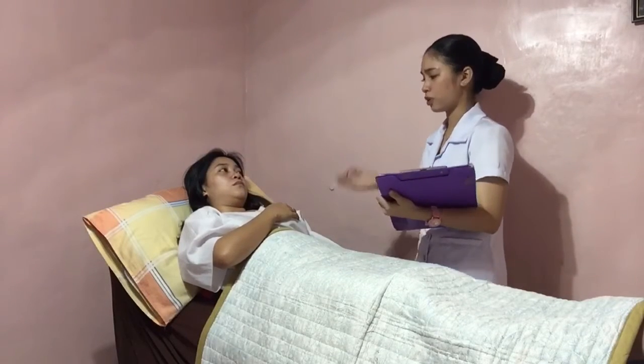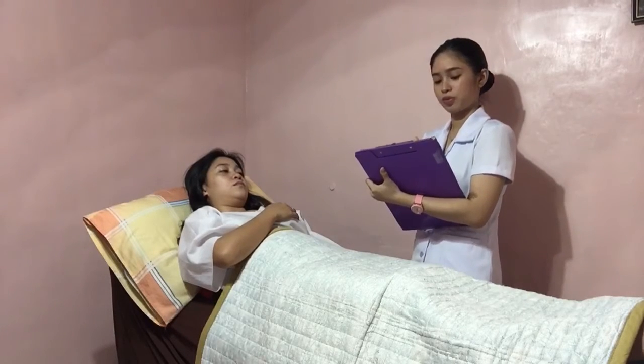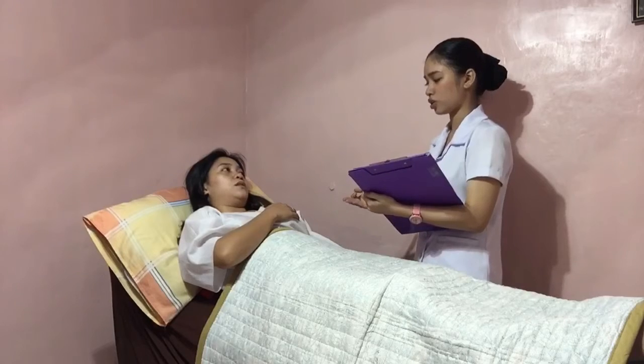So Althea, do you have any breathing problems? Okay, so your respiratory rate or your breathing rate is 17, which is within a normal range. So any clarifications or questions? Okay.